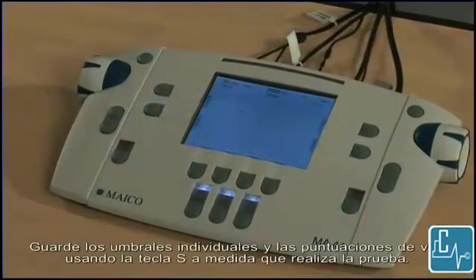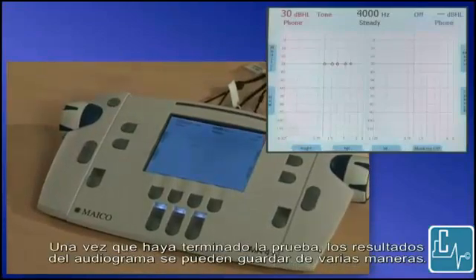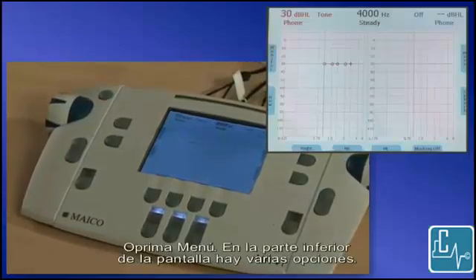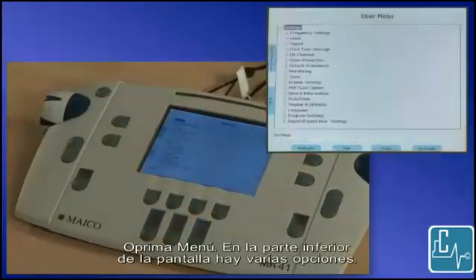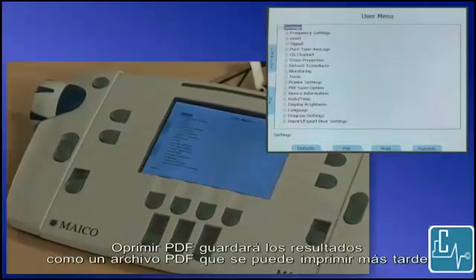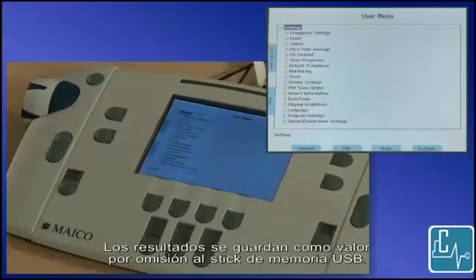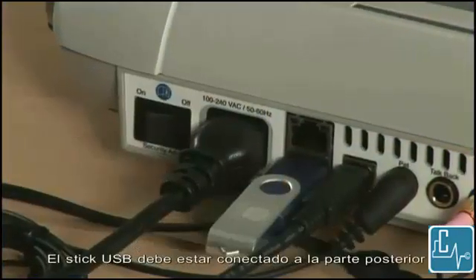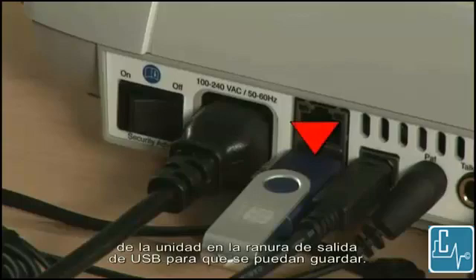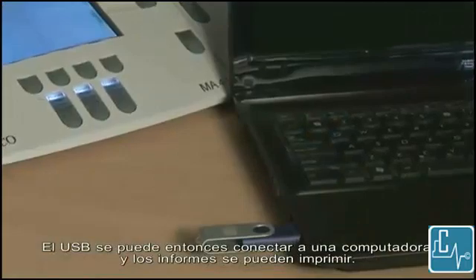Save individual thresholds and speech scores using the S key as you conduct the test. Once the test is finished, the audiogram results can be saved in several ways. Press menu. At the bottom of the screen are several options. Pressing PDF will save the results as a PDF file that can be printed out later. The results are saved by default to the USB memory stick. The USB stick must be plugged into the back of the unit in the USB out slot in order for them to be saved. The USB can then be plugged into a computer and reports can be printed.